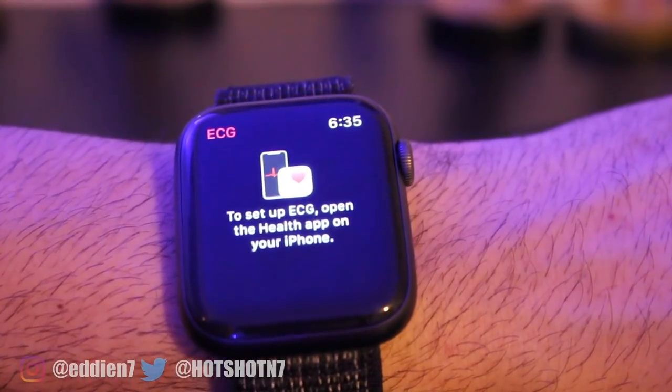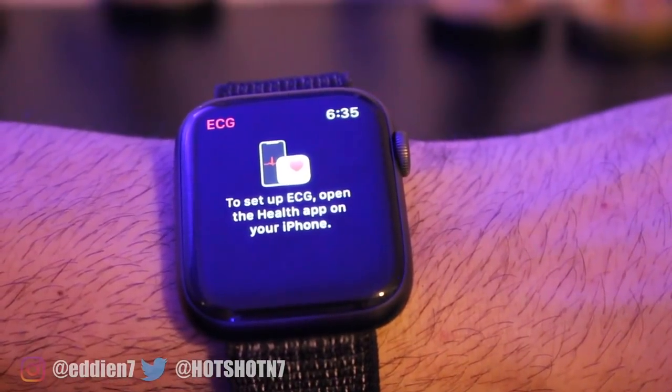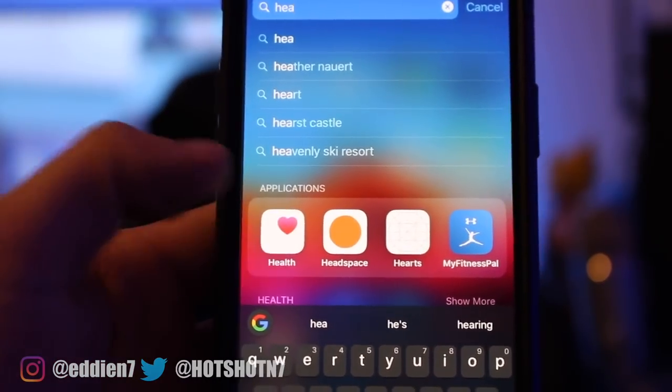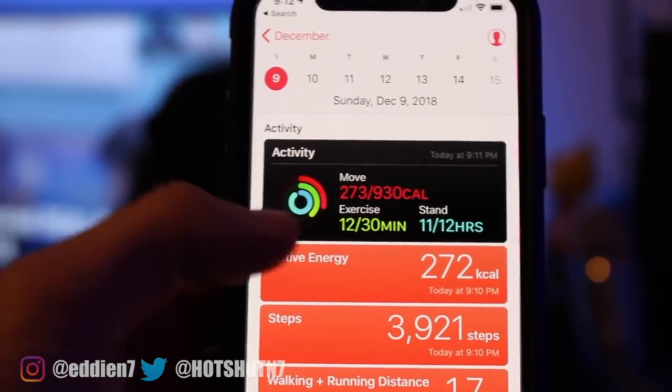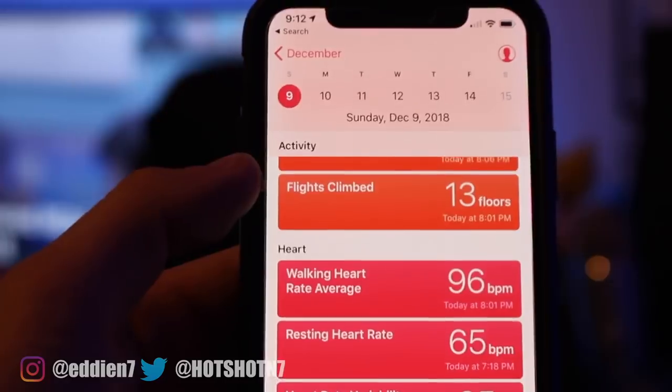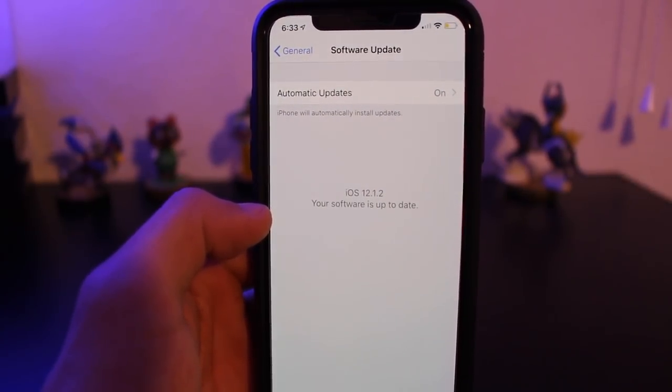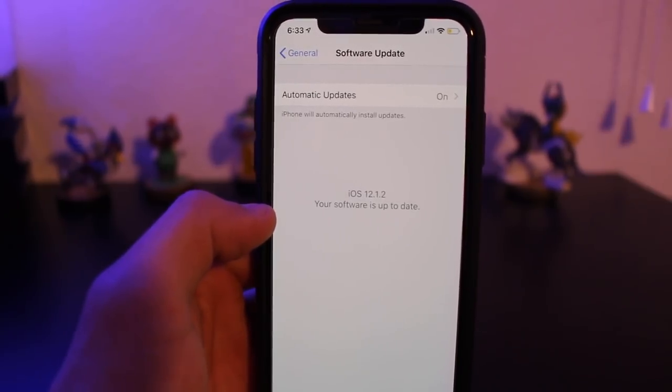Once you click on it, a message will appear letting you know you need to open up the Health app. If you go ahead and do that on your iOS device, nothing's gonna pop up about ECG — that is because you need to be running iOS 12.1.2 or newer, which supports ECG.